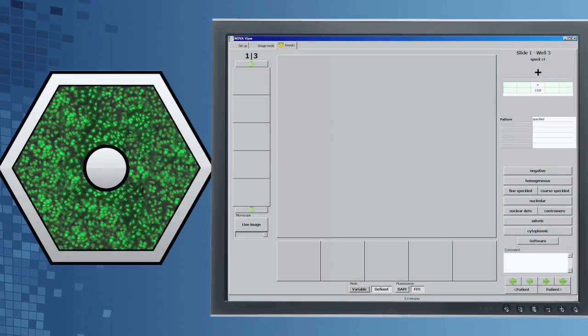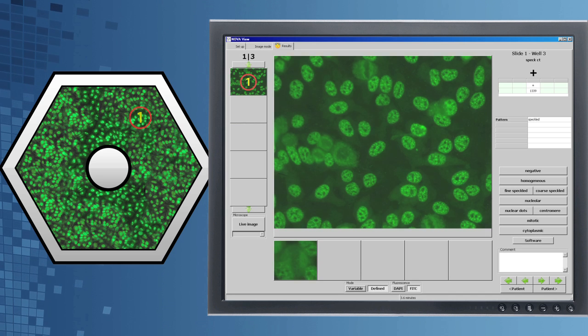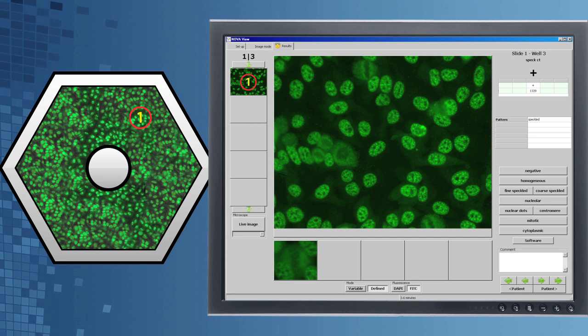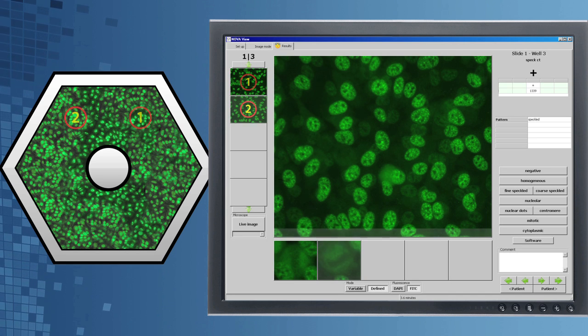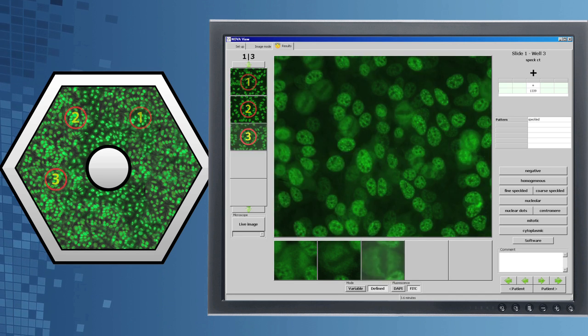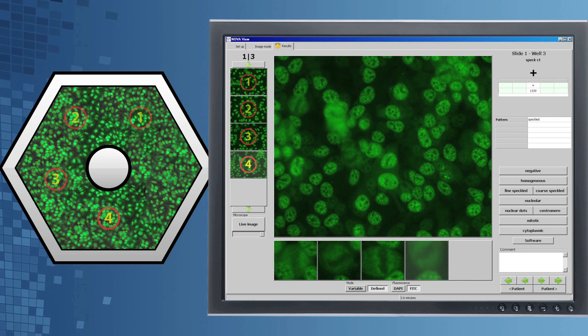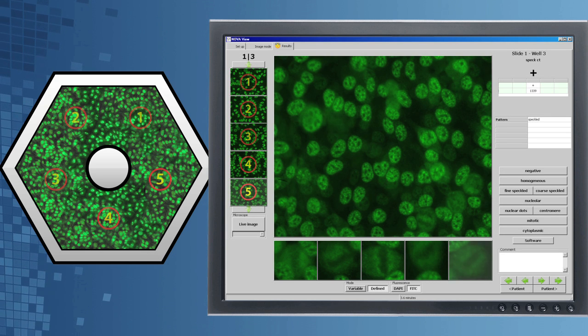NovaView uses mathematical algorithms to analyze each field of view and takes five digital images for each positive sample and three digital images for each negative sample.